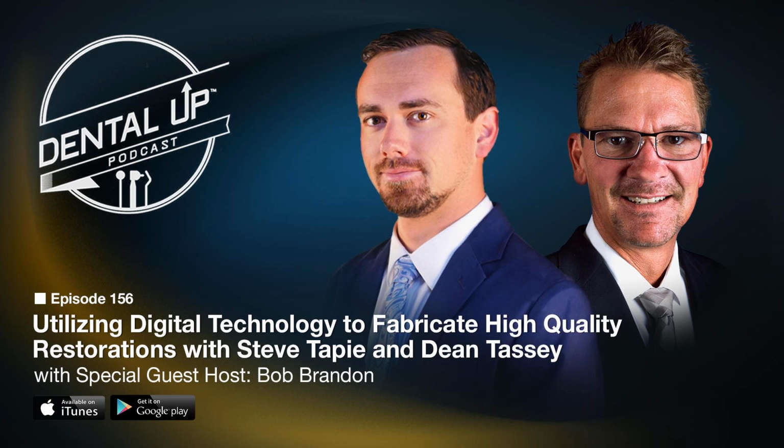Having a modeless night guard would be very fast and convenient. Yeah. And beyond that, having a digital copy of the design would mean reprinting or making a replacement very easy and very quick. Sure. And that holds true for full arch dentures as well.